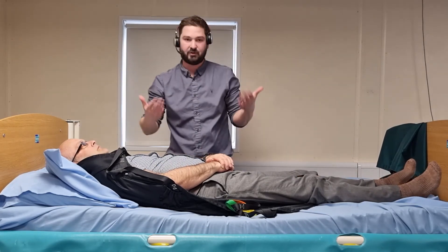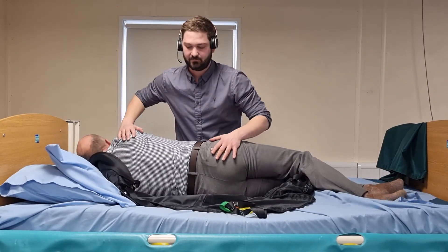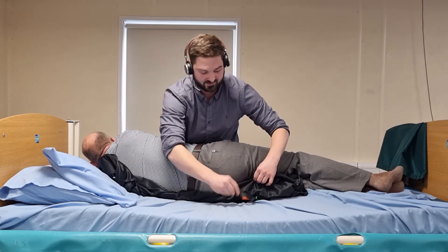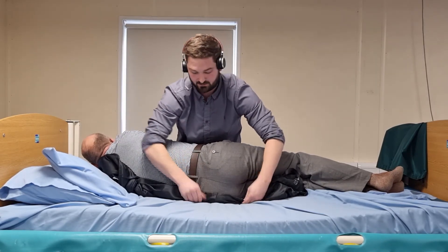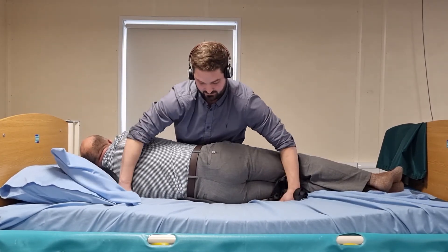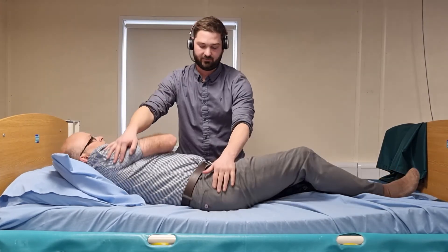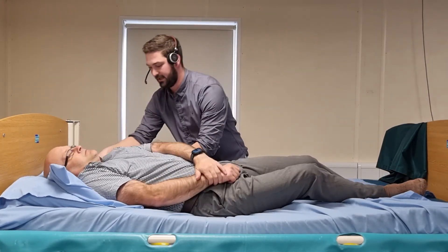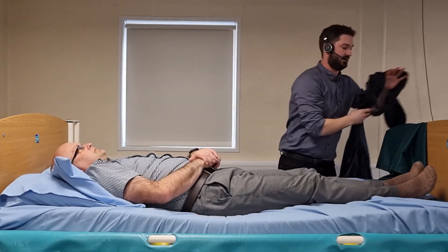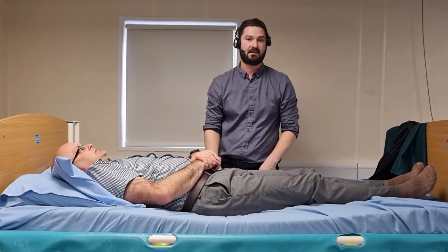I'm going to ask my person to roll towards me into a side lying position. I'm then going to fold the sling up underneath, ensuring that the tapes go underneath as well. I'm going to use the softness of the bed to push down underneath his body. He can then roll back onto his back, and I should be able to ease the sling through nice and carefully. And that is the fitting and removal of an in-situ sling in a lying position.